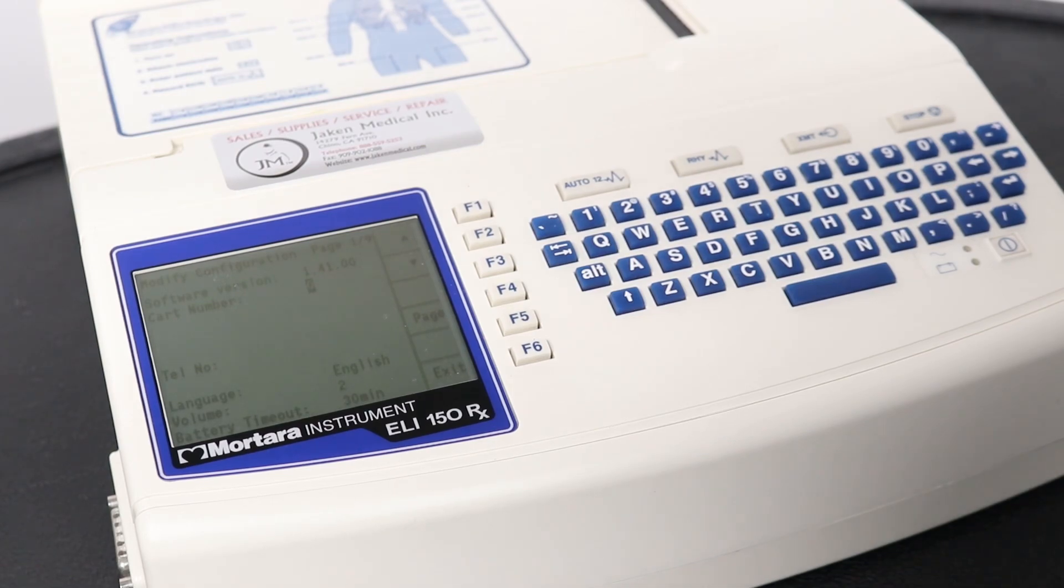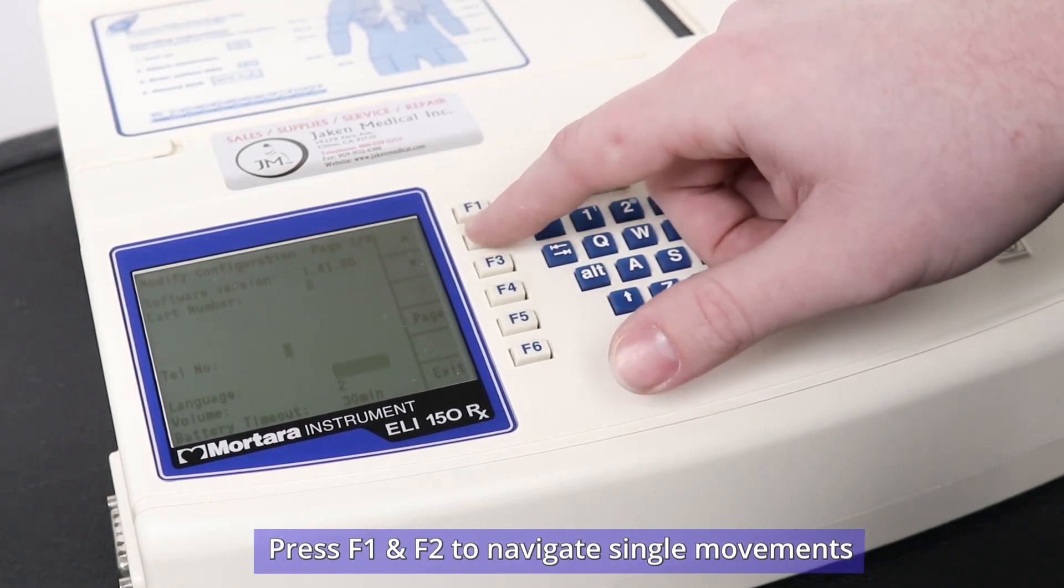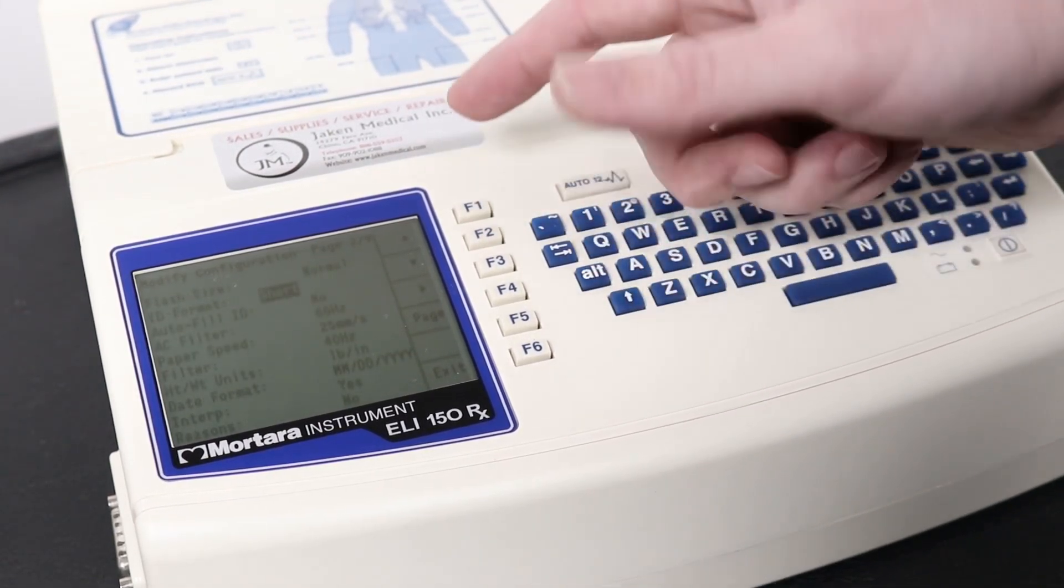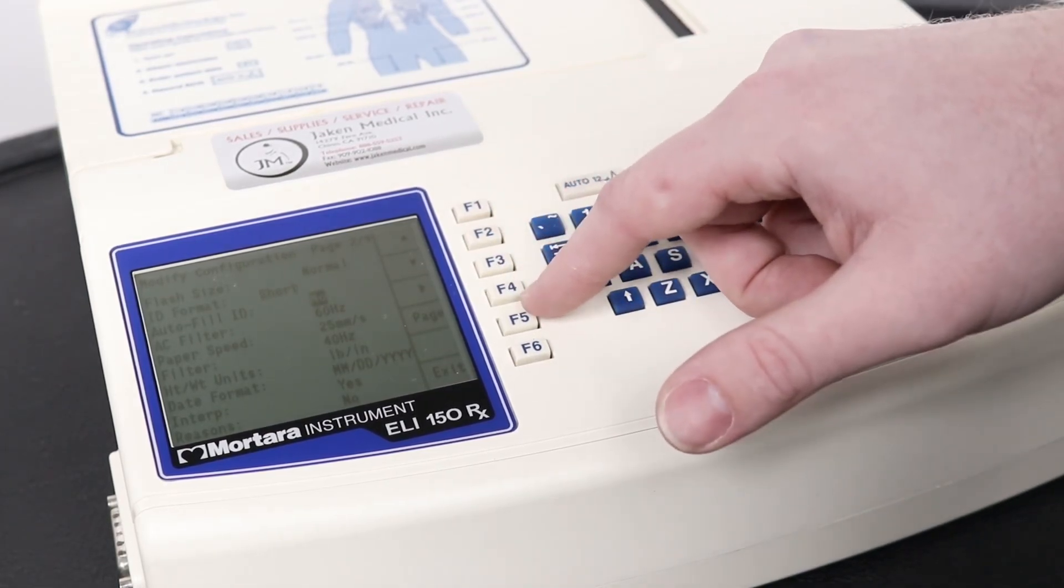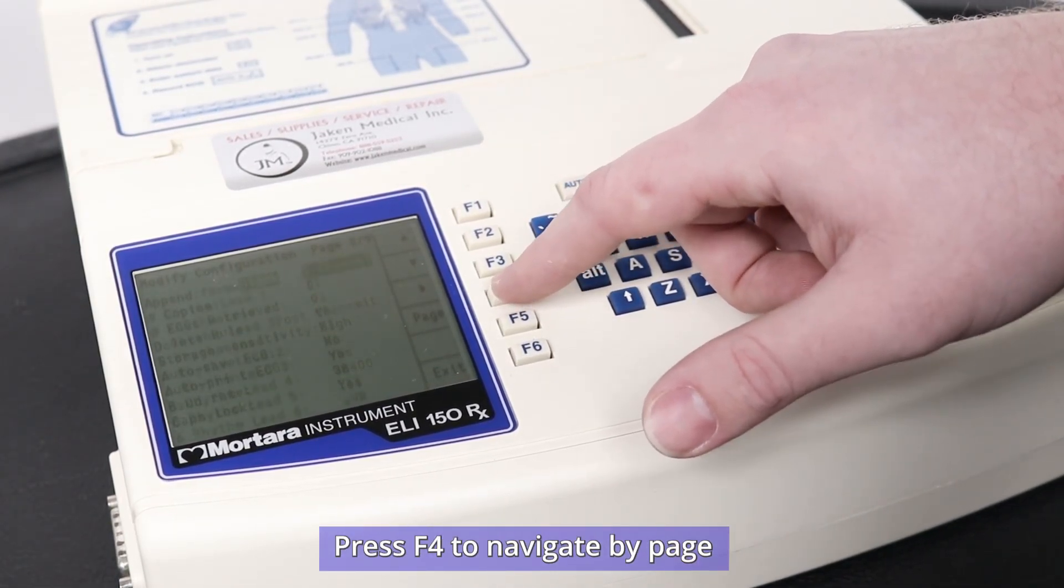Once in the service menu, there are multiple areas that you can customize to fit your needs. To navigate, use F1 and F2 for single movements, or you can use F4 for page to go through the page quickly.